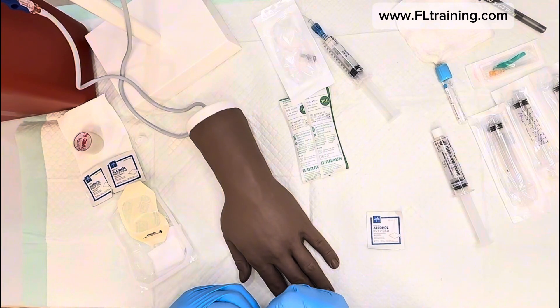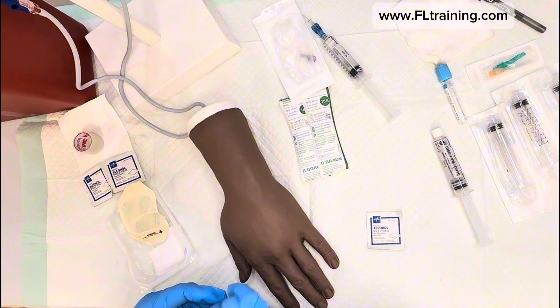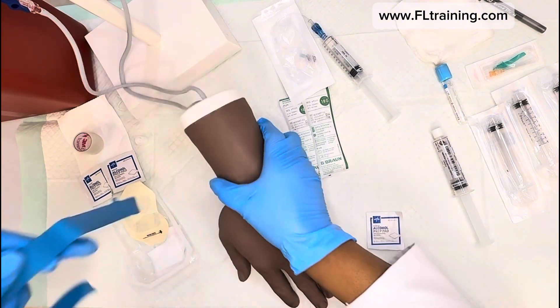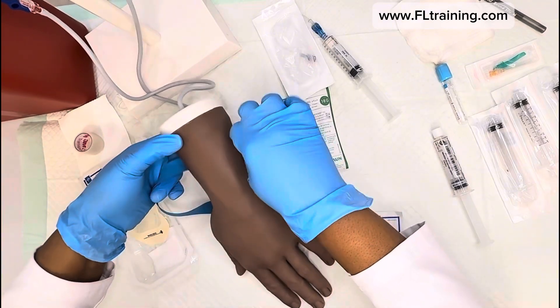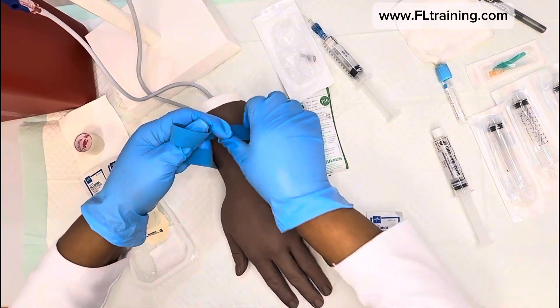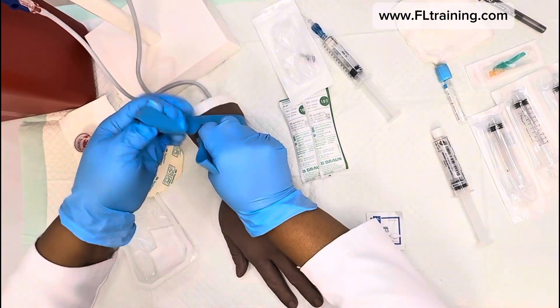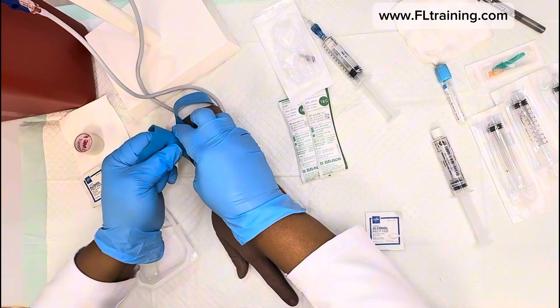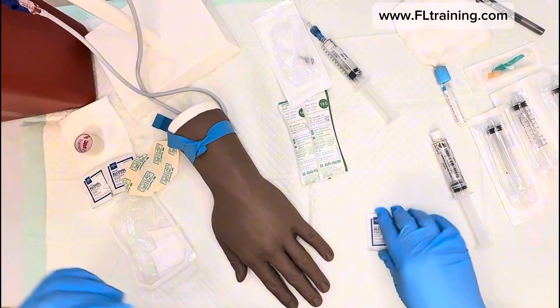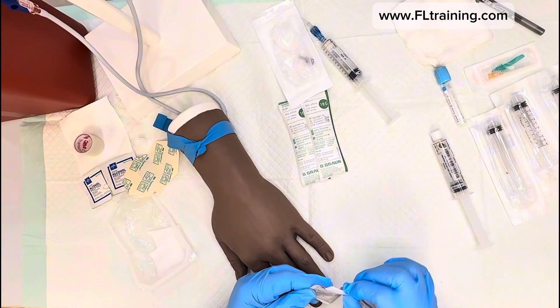Our patient has given permission. We're going to put on the tourniquet. I've already done site selection — this is the left hand, the patient's non-dominant hand, and we're going to start distally. Whenever we start an IV, we like to start lower. A lot of people want to go for the antecubital or bend of the arm, but that's not always best — if the patient keeps bending their arm, the IV may occlude.